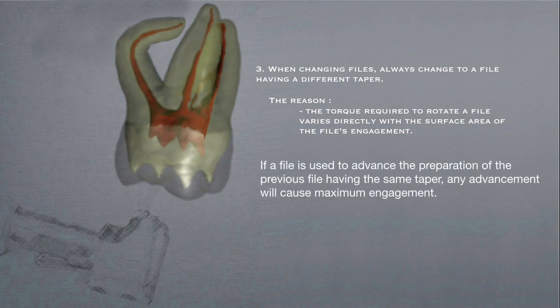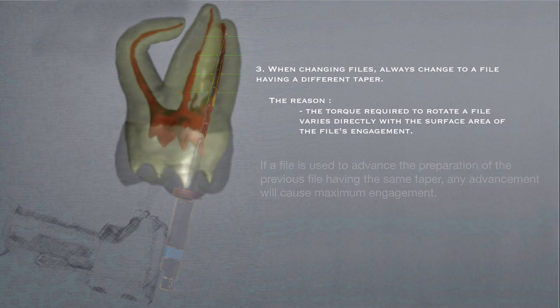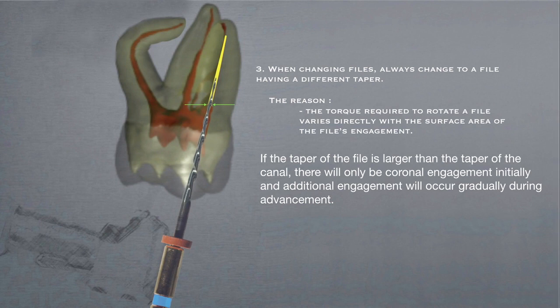If a file is used to advance the preparation of the previous file having the same taper, any advancement will cause maximum engagement. If the taper of a file is larger than the taper of the canal, there will only be coronal engagement initially, and additional engagement will occur gradually during advancement.